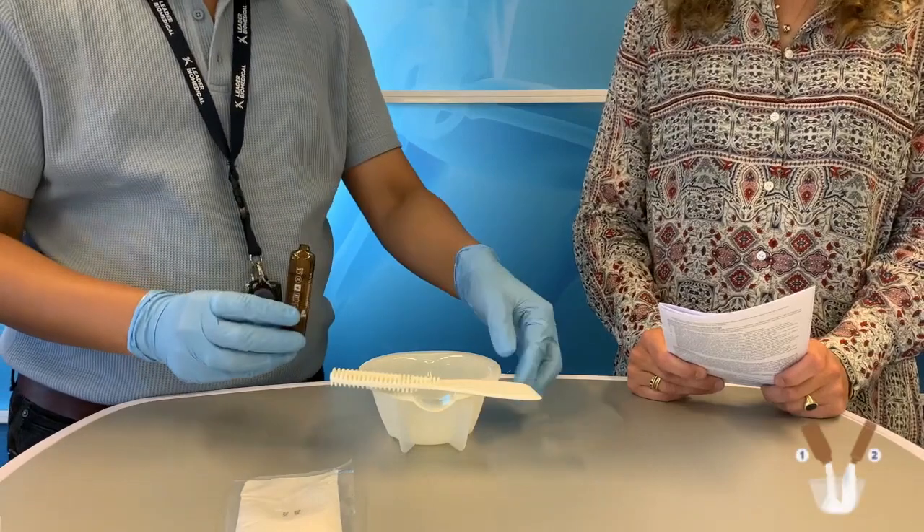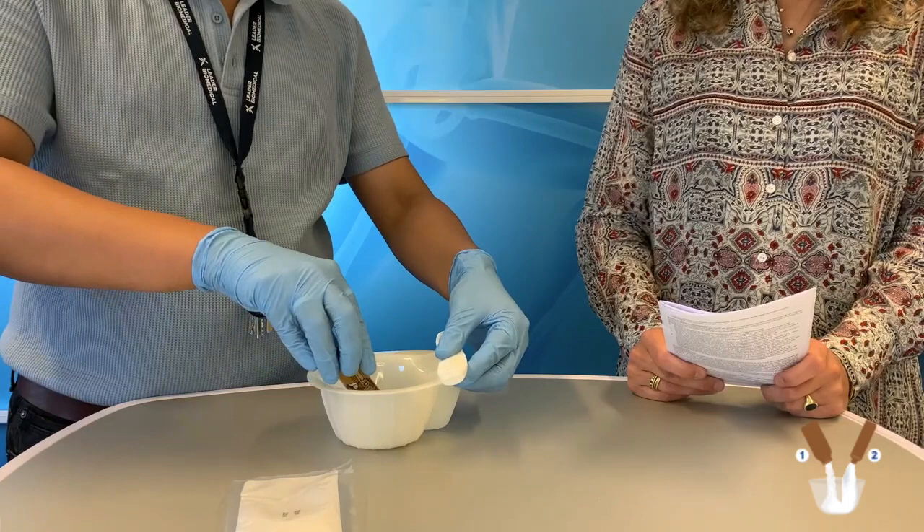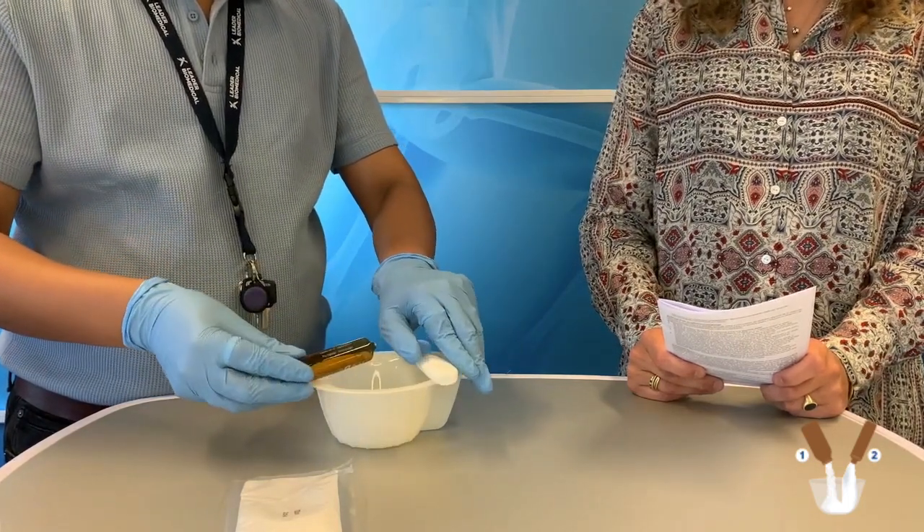The first step is to add the liquid to the bowl, at a calm pace to avoid spillage.